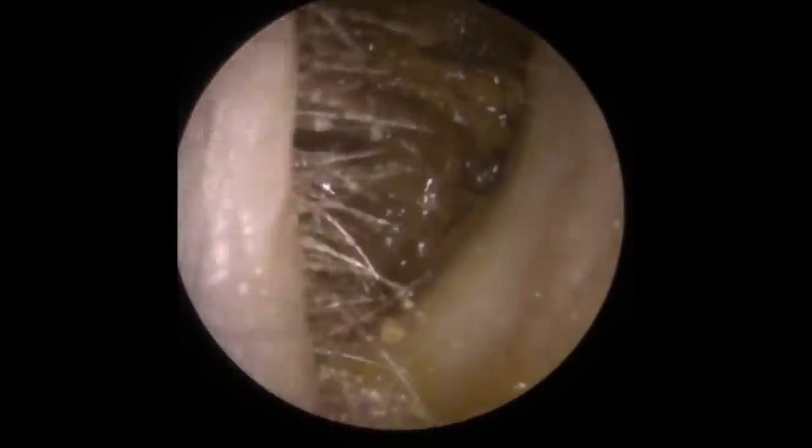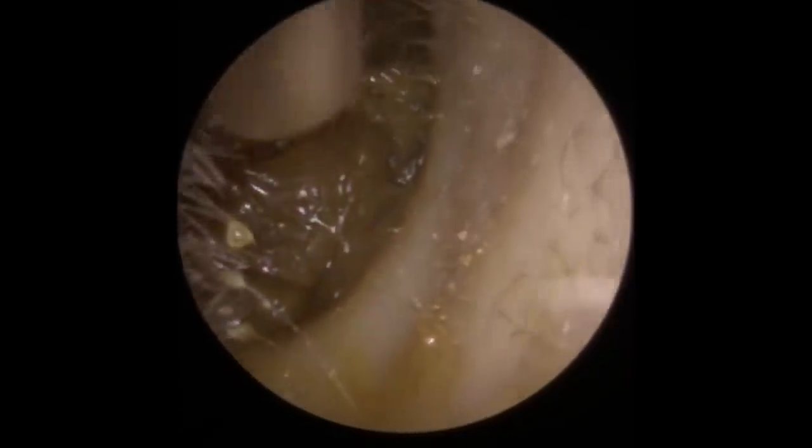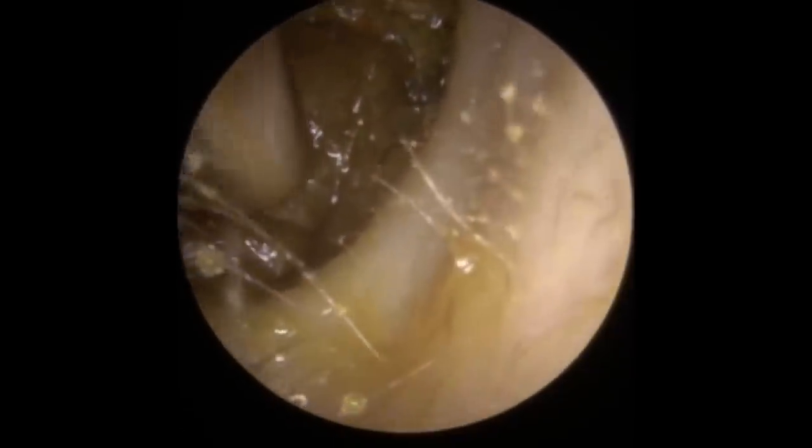So this is our second patient in the compilation. So this one's a bit more of a standard kind of wax problem for us. You can see it's quite a large, thickened up layer of wax in here. So this is the standard size Zollner tube now. Just getting a grip on the outside edge. You can see there's a long strip of dry skin there, getting sucked into the machine.